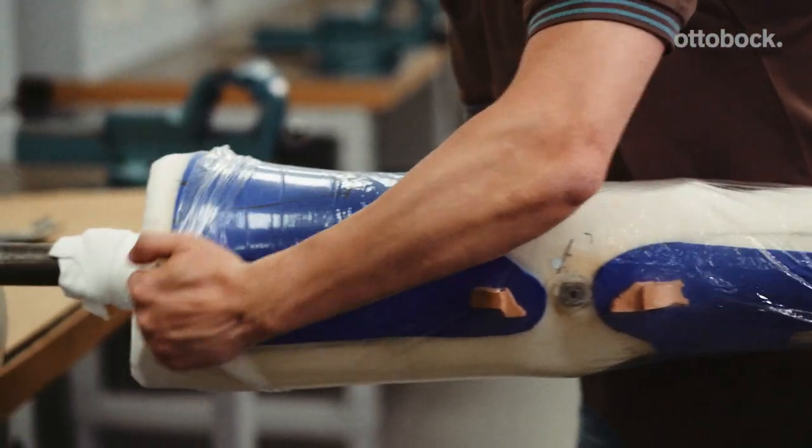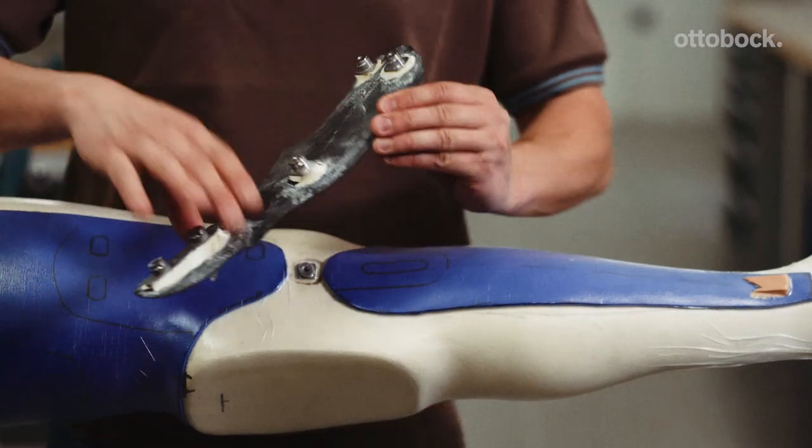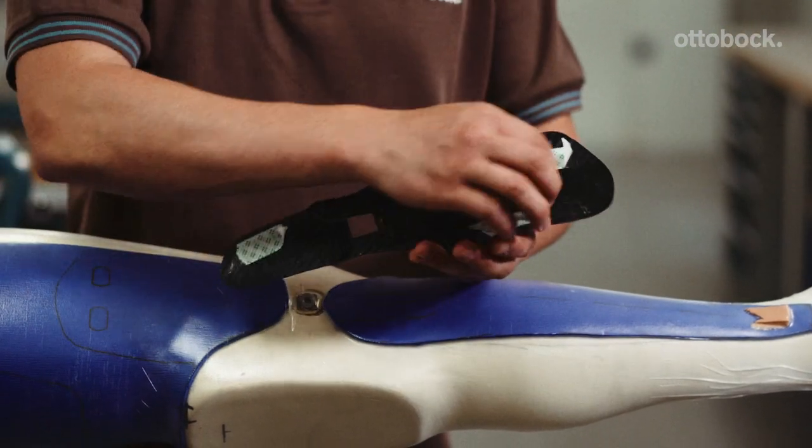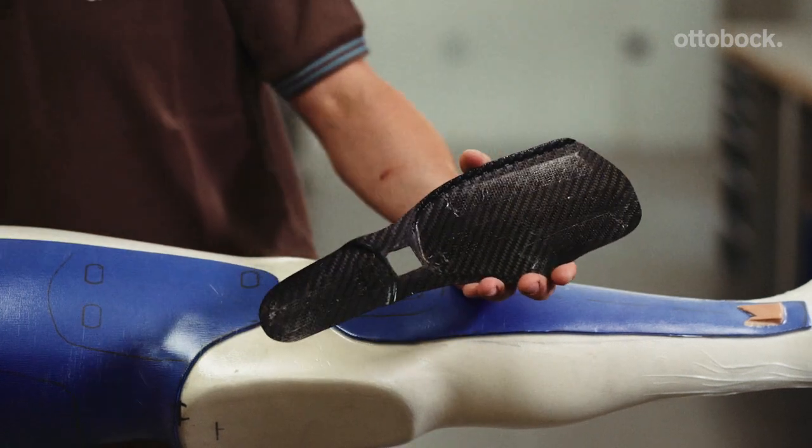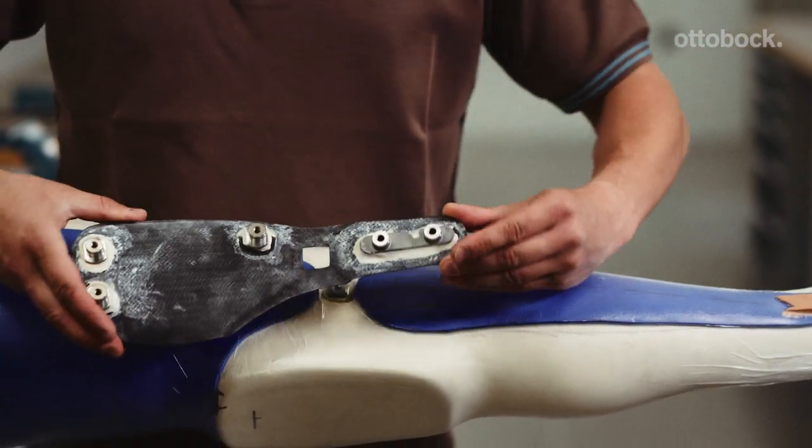Pull a PVA bag over the model and connect the vacuum. Attach the inner shell, including the positioned anchor nuts and anchor plate, to the model with double-sided adhesive tape.